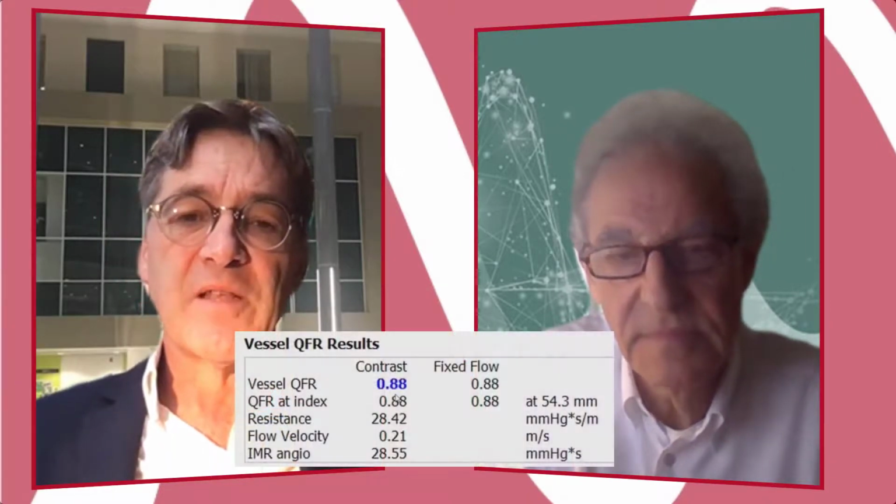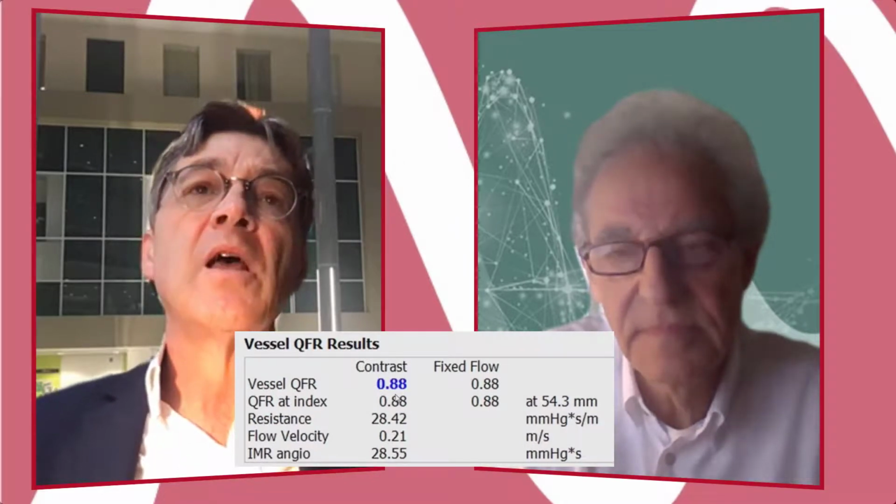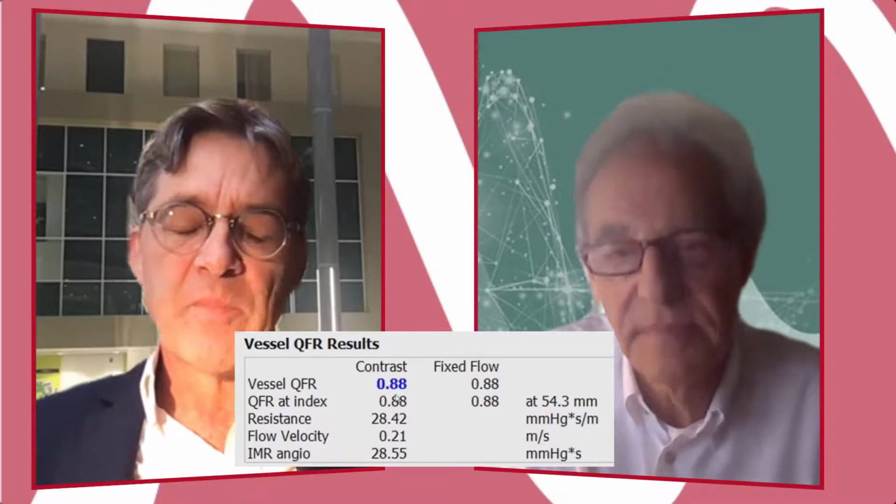This was post-STEMI. Yeah. And it was very interesting because it was a patient that probably had a high IMR to start with, no flow at some stage of the procedure. And still, 3 weeks after the initial event, when we did the measurement you just mentioned, we had a slightly elevated IMR.